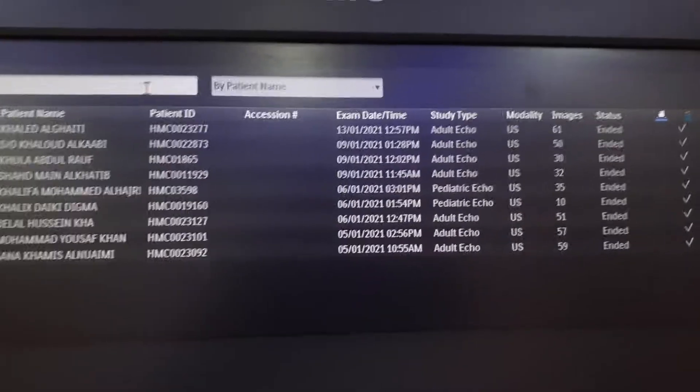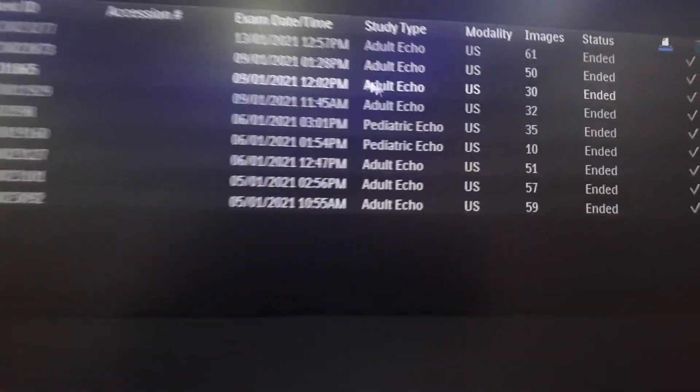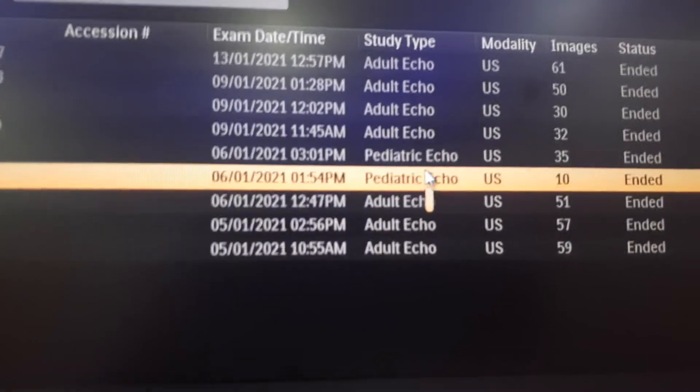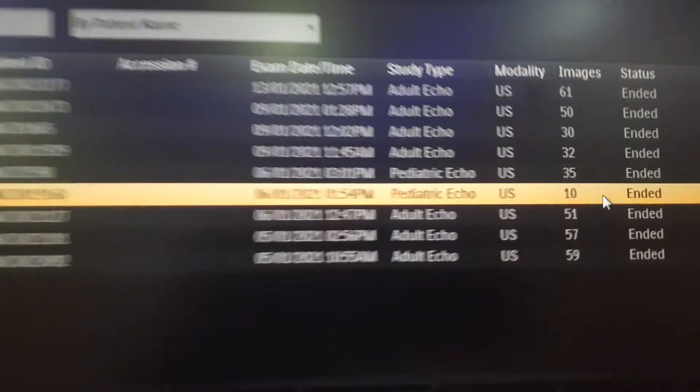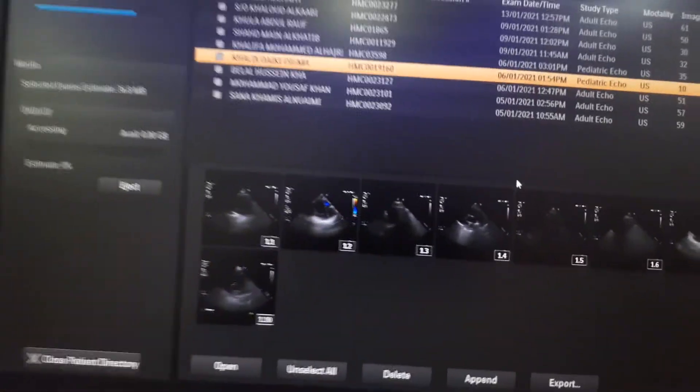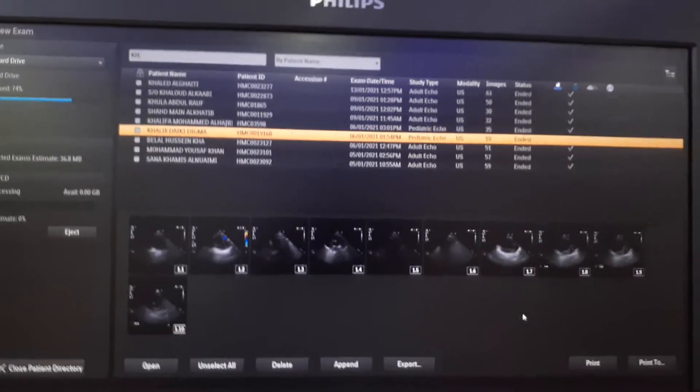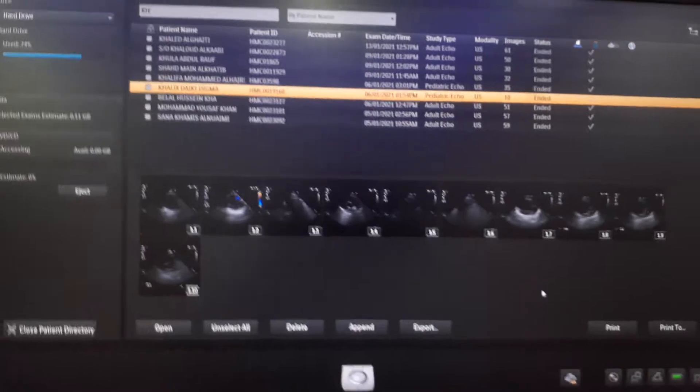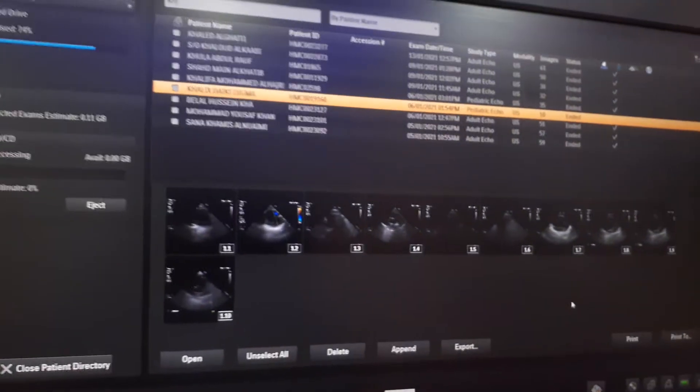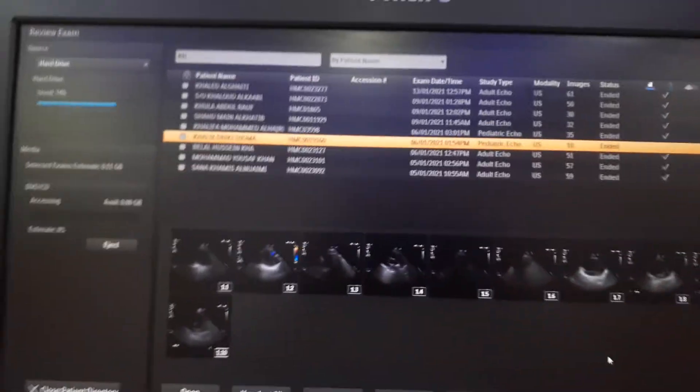This one has 10 images also - 7 clips and 3 normal images. But the data size here you can see is 100+ megabytes or 0.11 gigabytes.